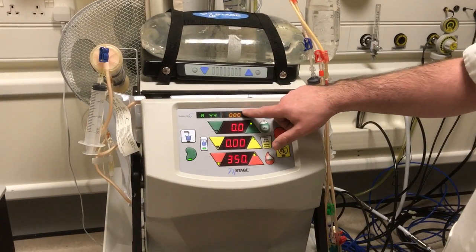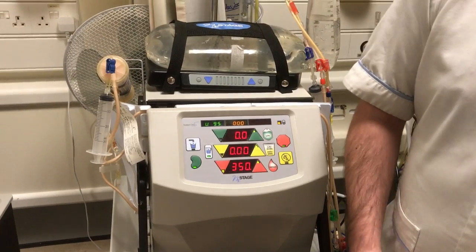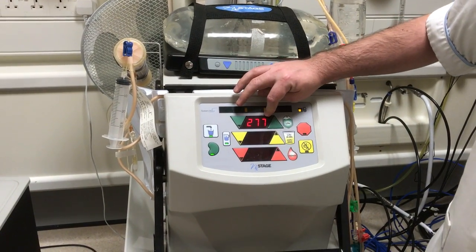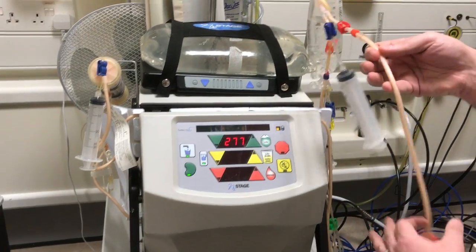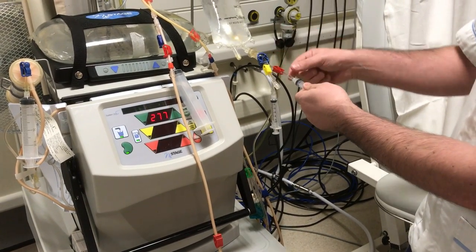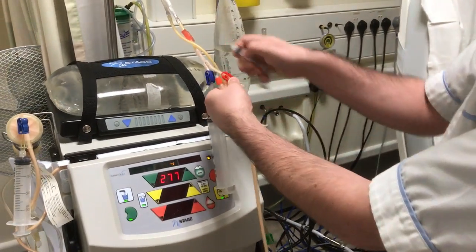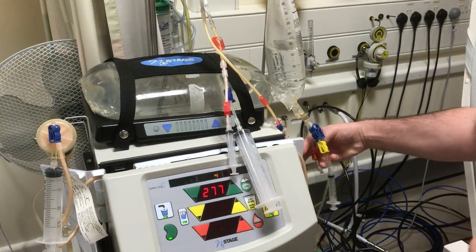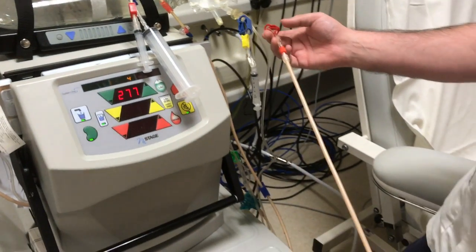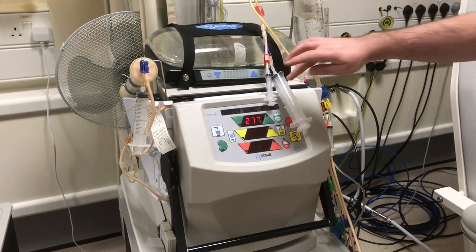Once you finish your treatment you will get the three zeros. Once these have come up, make sure your pack is ready, your table, your tapes, all your preparation is done. Once that's all ready, we can press the stop key. You see the machine comes up with 277. We then clamp our red arterial line and take off the syringe on the red line on the saline bag. We swap the syringe and the bloodline so the syringe goes onto your needle and the bloodline on the red side goes back to the saline bag. We open both clamps and press the add fluid button — this will now count down to zero.